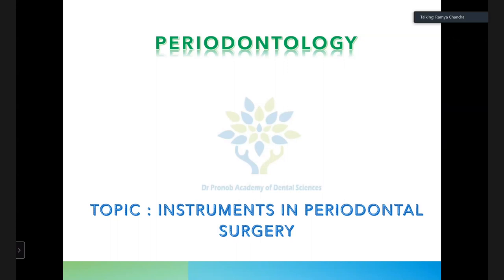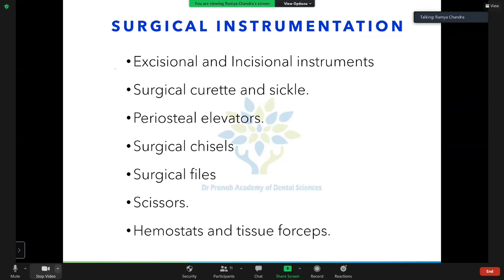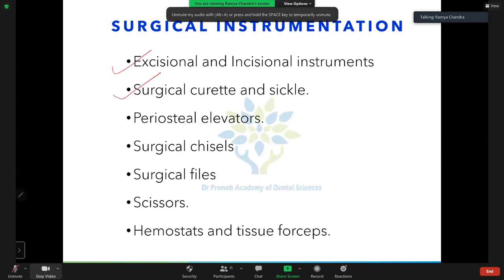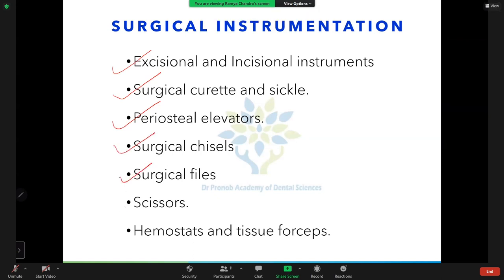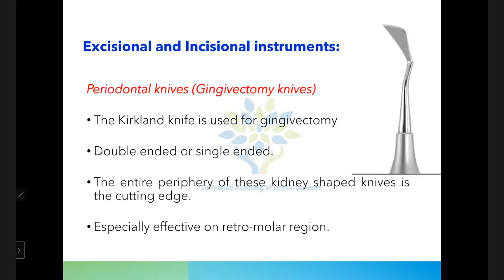Today's class is about instruments used in periodontal surgery. The instruments are classified into: excisional and incisional instruments, surgical curets and sickles, periosteal elevators, surgical chisels, surgical files, scissors, hemostats, tissue forceps, and miscellaneous instruments.